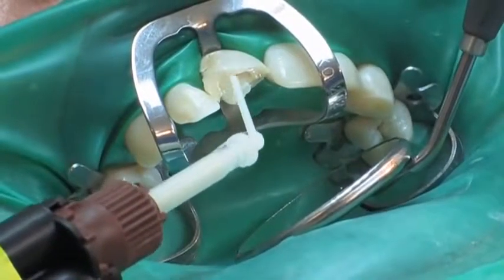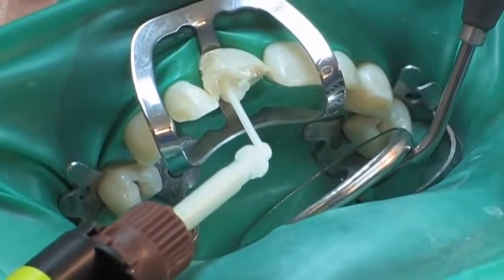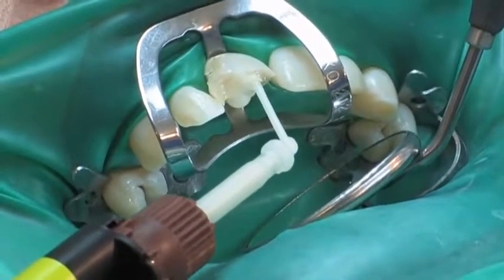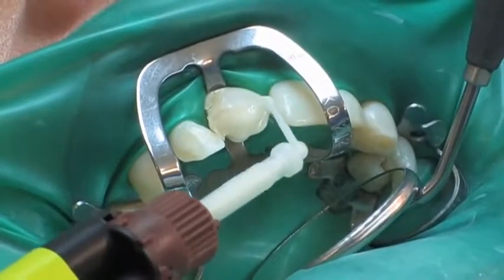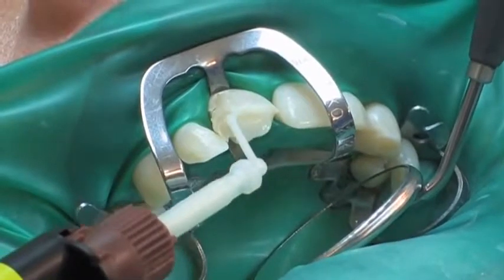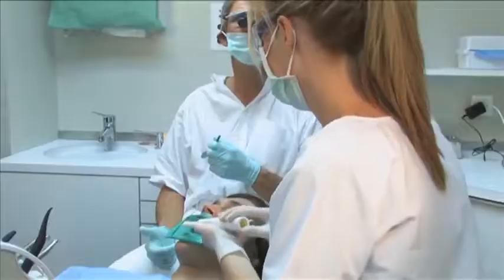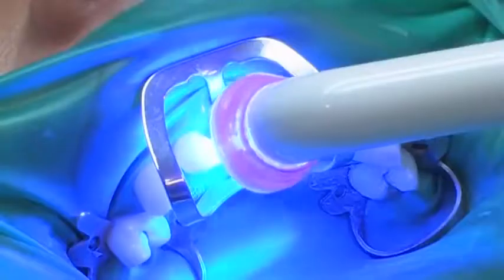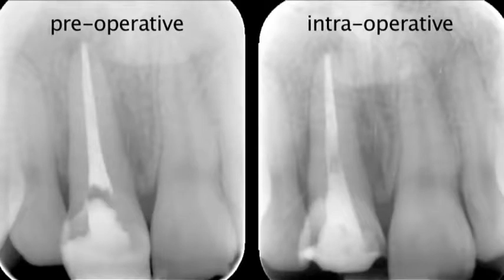Without any further delay, the core build-up can be fabricated. The non-slumping consistency of ParaCore allows for free hand modelling of the core build-up and direct application onto the prepared tooth structure and retention head of the root canal post. The core build-up is light cured afterwards for 20 seconds per side. An intraoperative radiograph is taken showing the glass fibre post cemented in place.